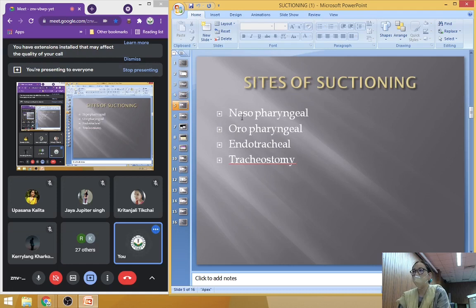Then the sites for suctioning are nasopharyngeal, oropharyngeal, endotracheal, and tracheostomy. You have heard of this, no? We have taken what suctioning is in the class. So I am going fast, okay? It is like a revision, I should say. Nasopharyngeal, oropharyngeal, endotracheal, and tracheostomy.